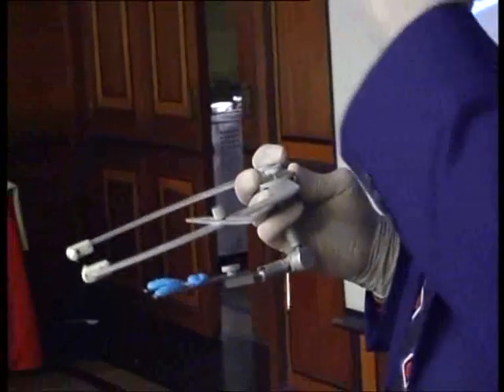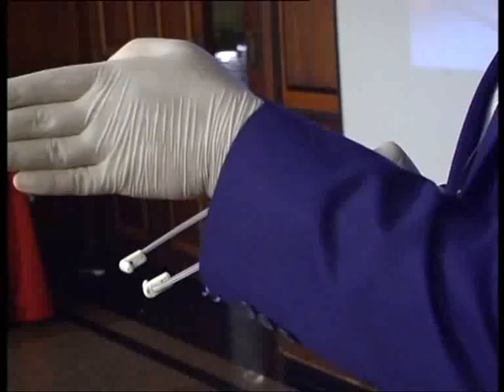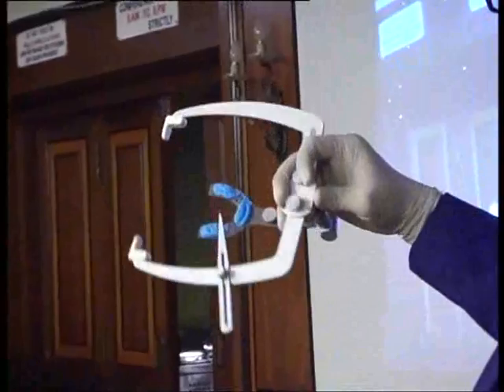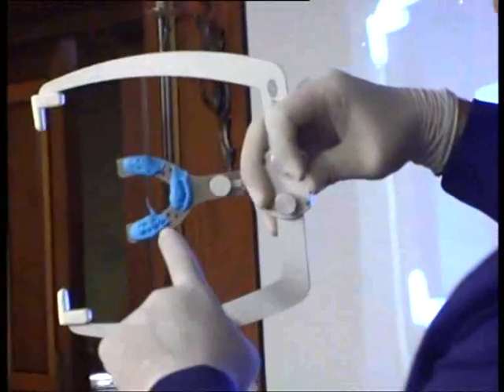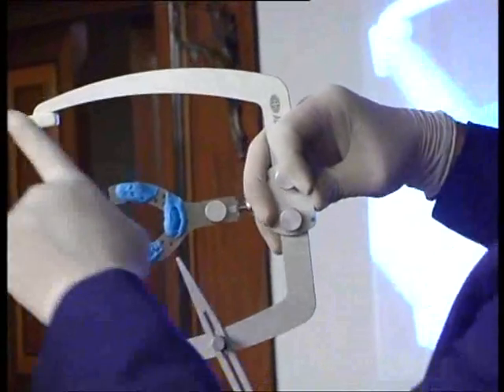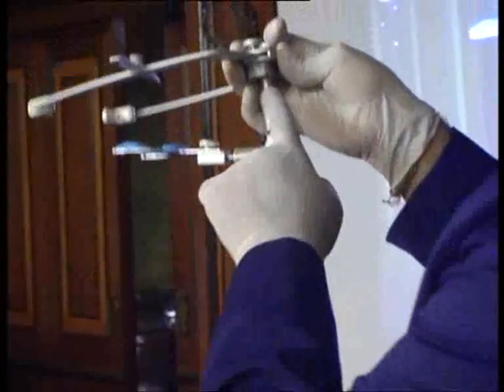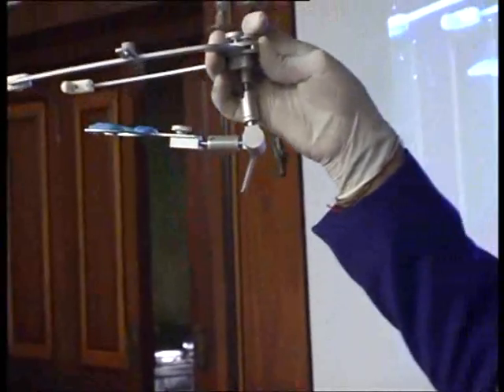If your fork has gone in correctly, everything will go smoothly. Most important is the positioning of the fork — it has to be in the center. This is how your face bow record looks: this is your anterior third point of reference, two posterior, one anterior, and the transfer assembly holding everything together.